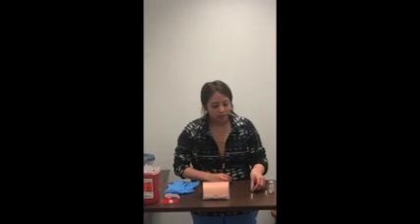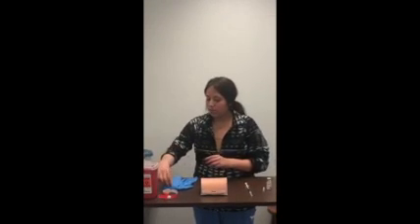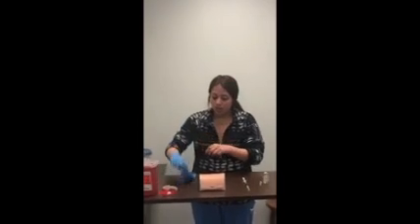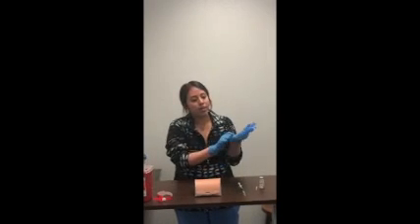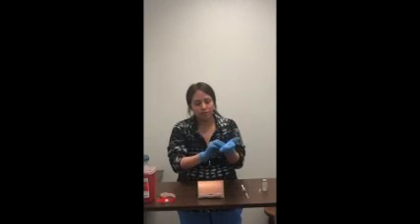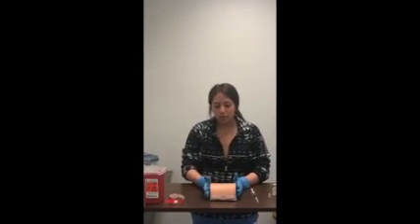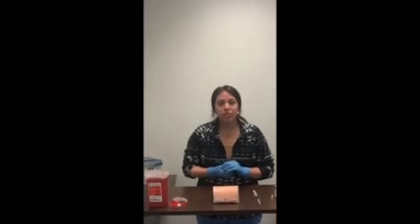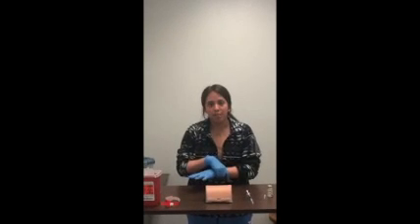I will then go into the patient's room, wash my hands, and apply my gloves. I will introduce myself to the patient and explain the procedure — in this instance, telling them I'm going to perform a heparin injection. I will then check the patient's allergies or allergy band indicating they are allergic to heparin.